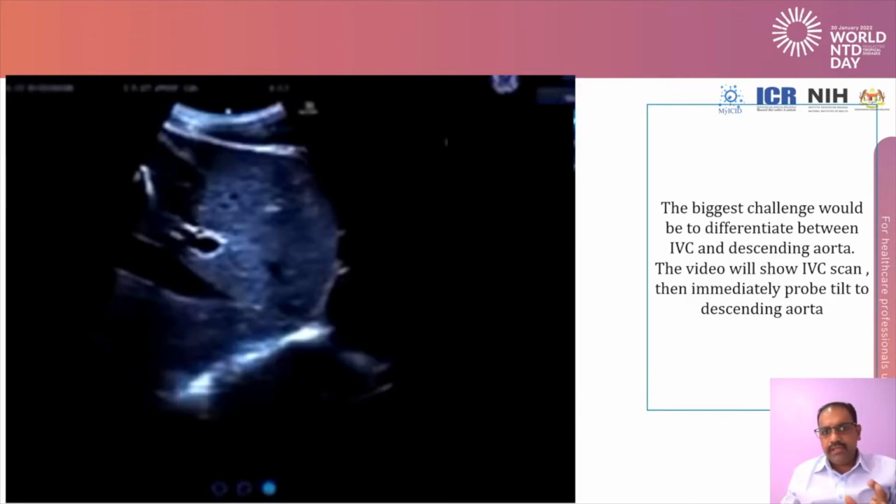So in this video, we are going to look at the common pitfalls, or the common mistake that all of us make. The biggest challenge when scanning the IVC is that sometimes we mistakenly scan the descending aorta and start to measure the descending aorta instead of the IVC, because these two lumens lie side by side, and you can commonly make this mistake. So before we go into detail to differentiate between the IVC and the descending aorta, I'm going to play a video.